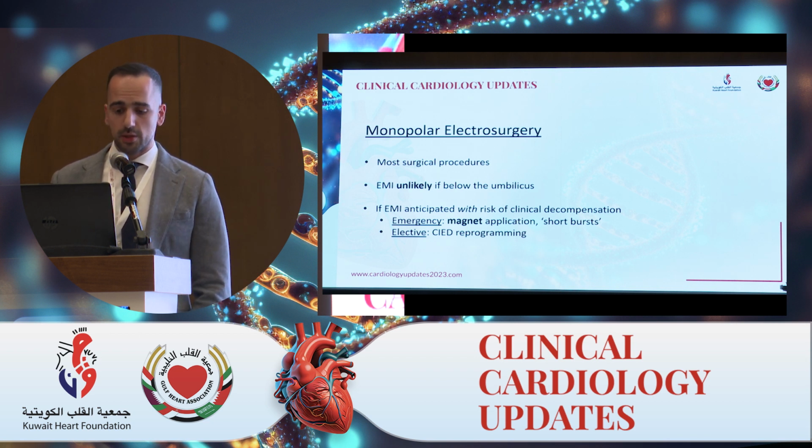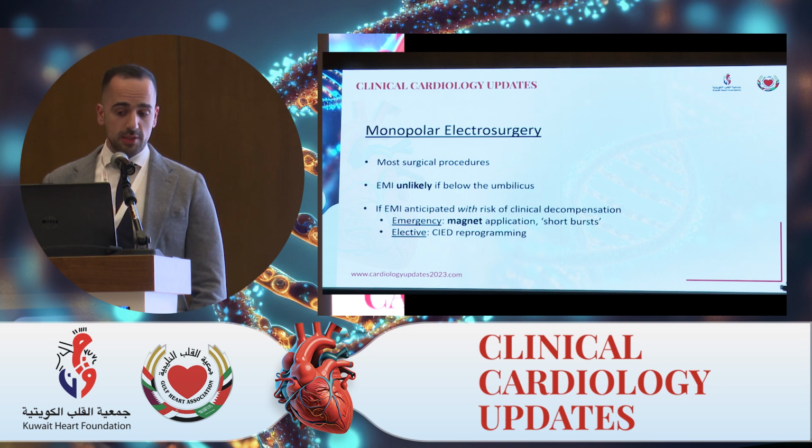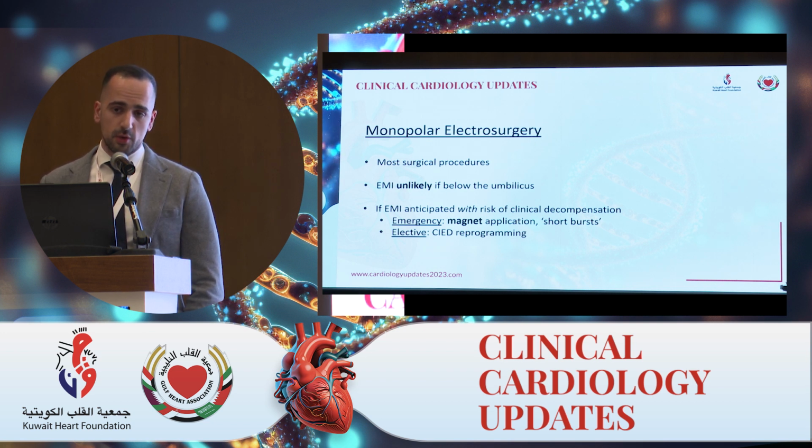But in a patient with EMI and anticipated risk of clinical decompensation, the approach will depend on whether this is an emergency or elective procedure. If it's an emergency, you can put on a magnet or try to limit the cautery to short bursts. However, if it's elective, you have time to assess the patient and reprogram the device based on the patient's needs.